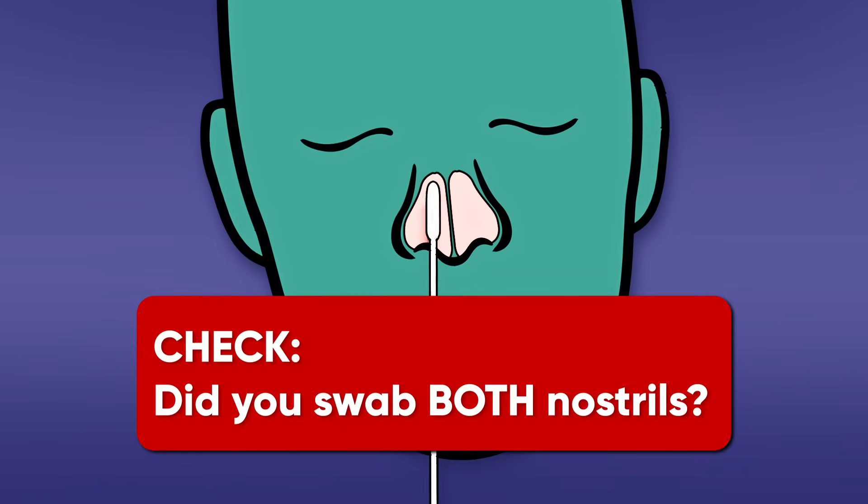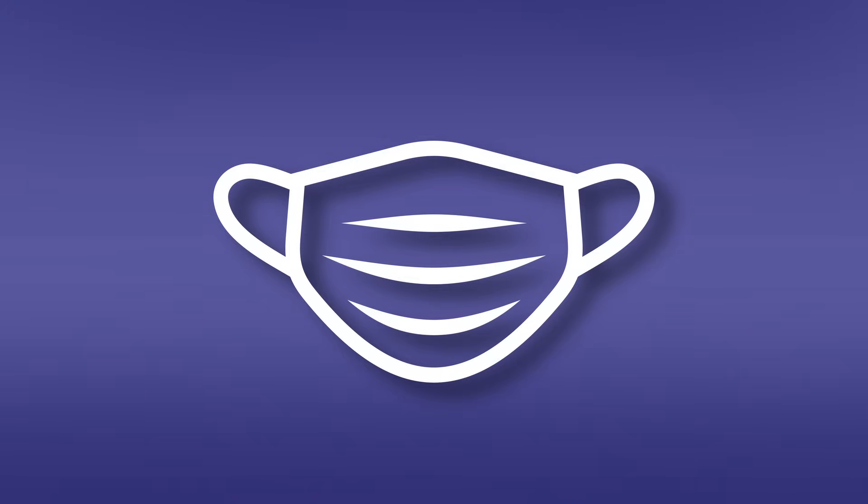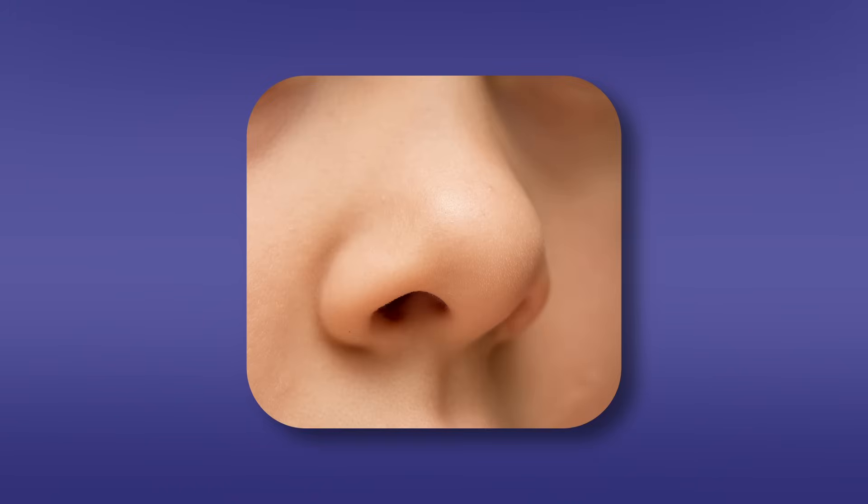Did you swab both nostrils? If you are swabbing others, please wear a face mask. With children, the maximum depth of insertion into the nostril may be less than one half to three quarters of an inch, and you may require another adult to hold the child's head while swabbing.